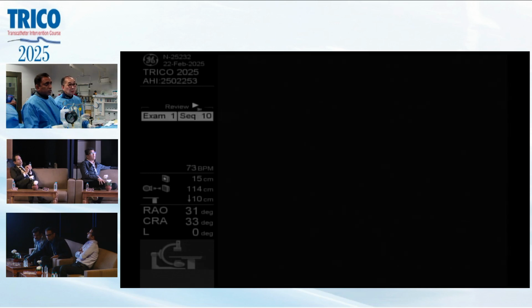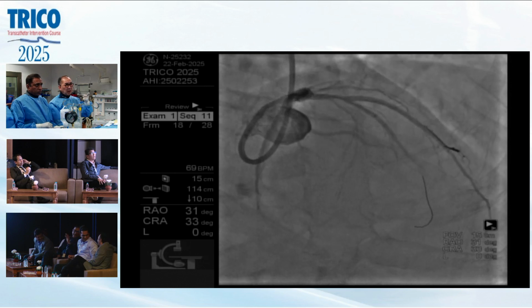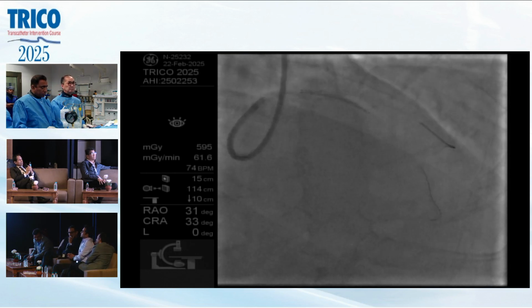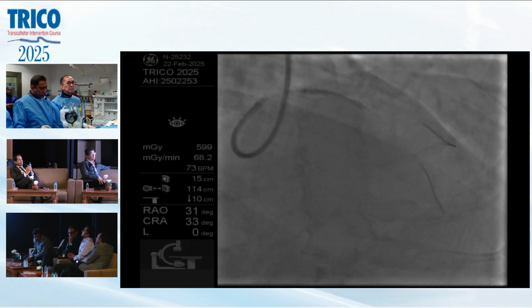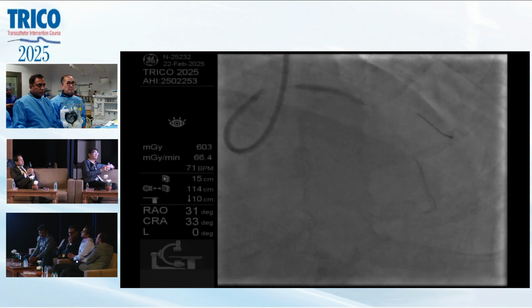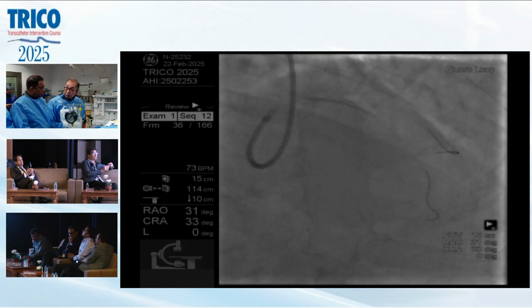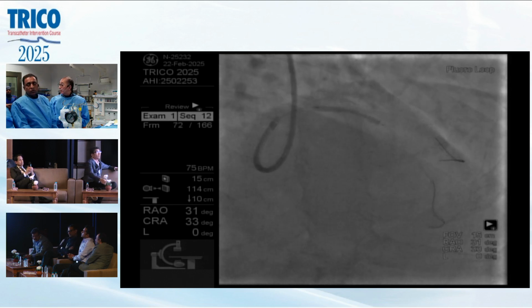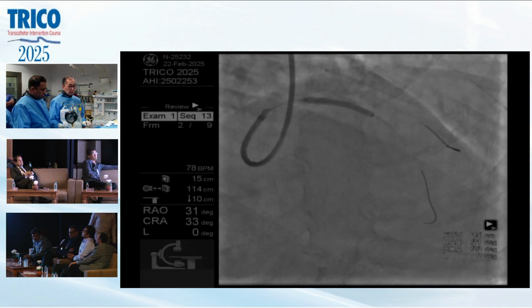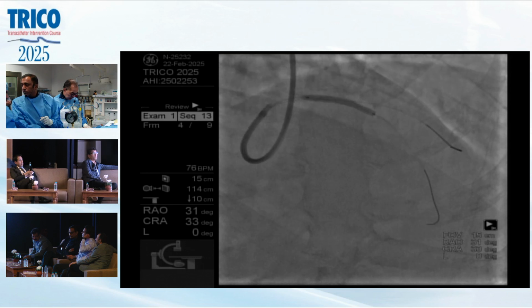And Tak, one more question, just planning ahead. When you think about proximal post dilation, proximal optimization, do you think about that, Tak? Do you think about how much proximal stent you have per POT? And then the POT is very important. We go to get a 4 proximal, 4.0 by 8 NC, or 4.0 by 6, a 6 or 8 millimeter NC balloon.